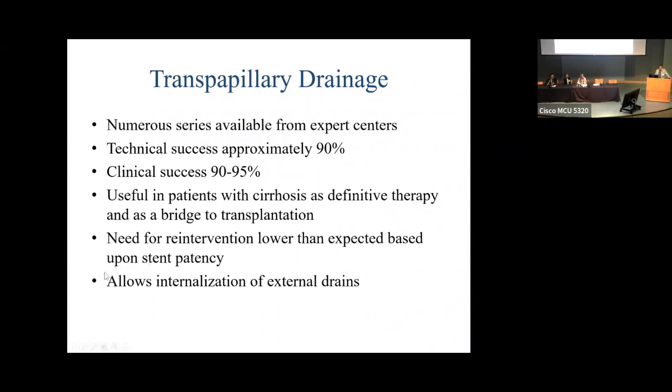The other thing is that it can allow internalization of external drains, meaning that if a patient came in and underwent a percutaneous procedure to drain the gallbladder, but yet they don't go to surgery, you can go back in and place a transpapillary stent and then remove the percutaneous drain.